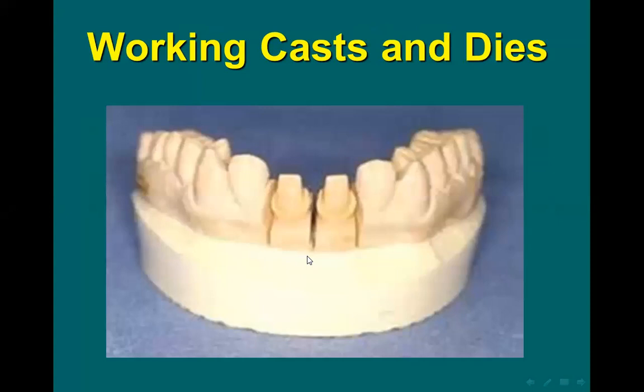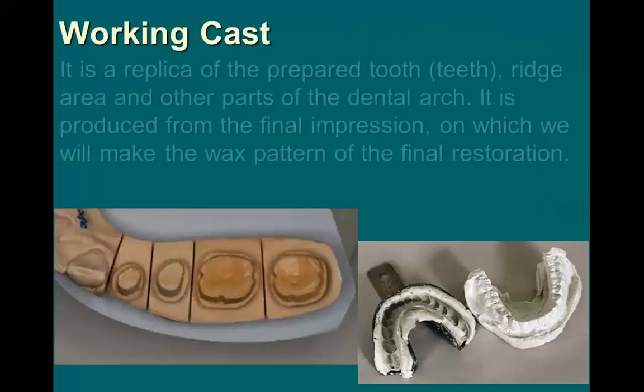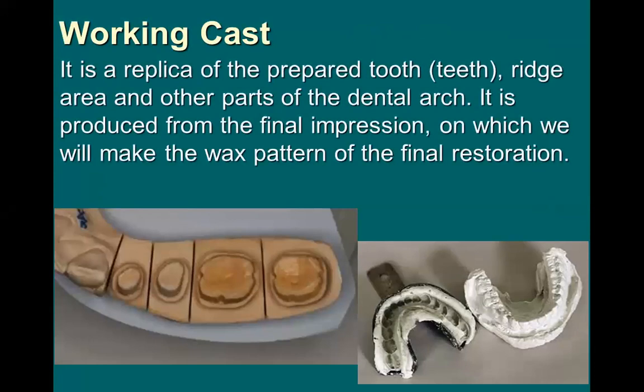The working cast and dies is defined as the replica of the prepared tooth. It is the positive.